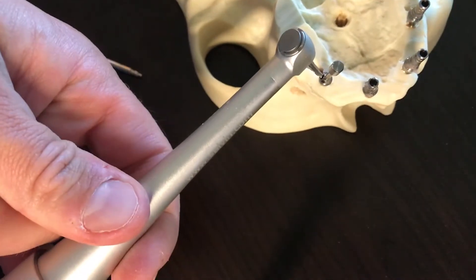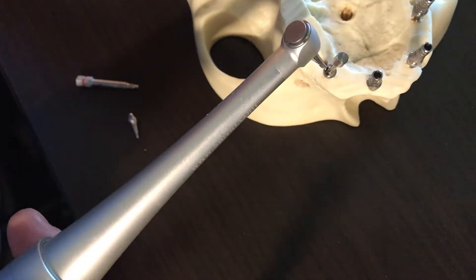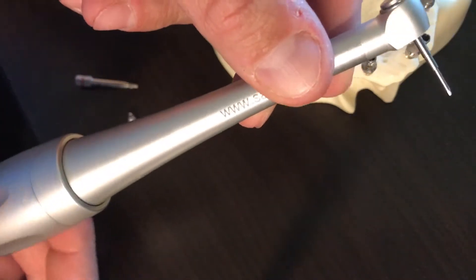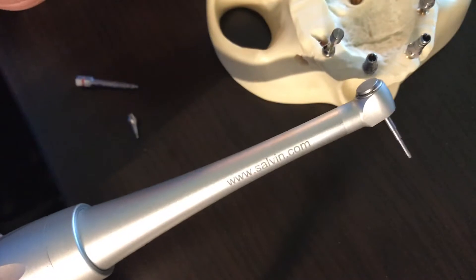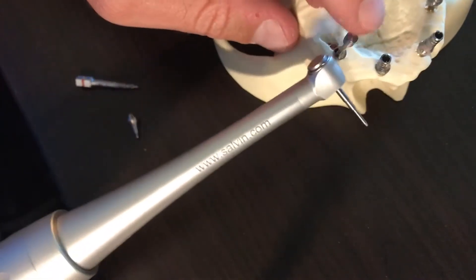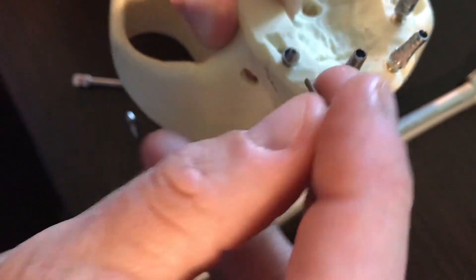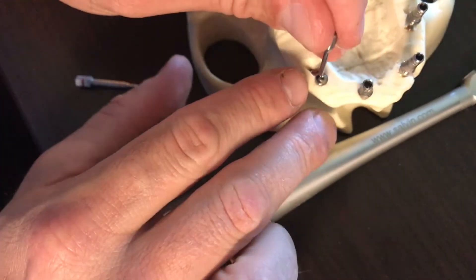This can save a ton of time. I've actually seen a doctor spend 45 minutes trying to get an abutment seated properly because it was not engaging and it kept slipping. This delivery arm here, which is removable, is very helpful to help line up your angle.